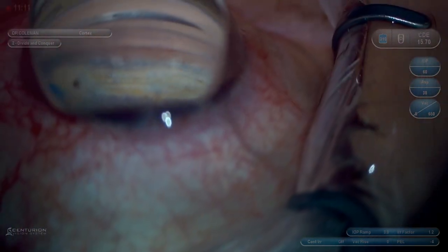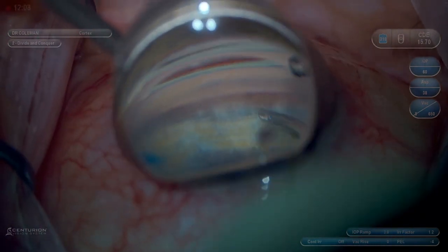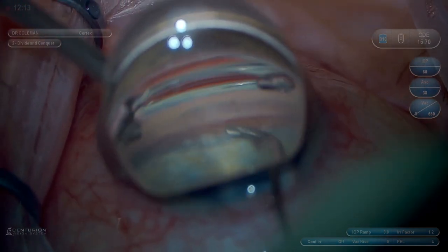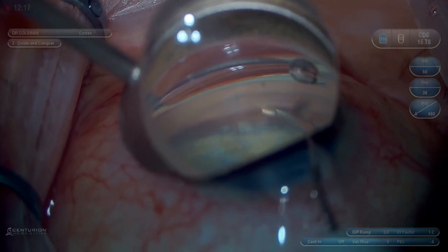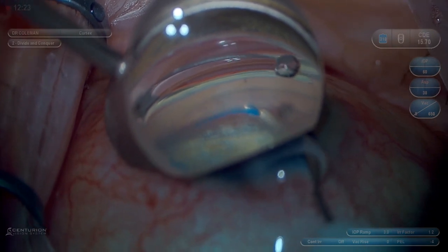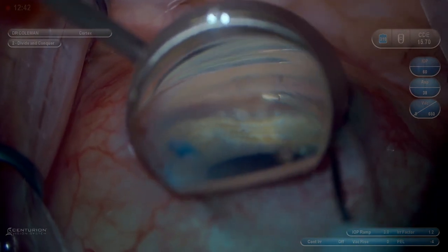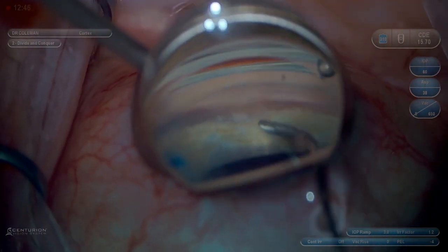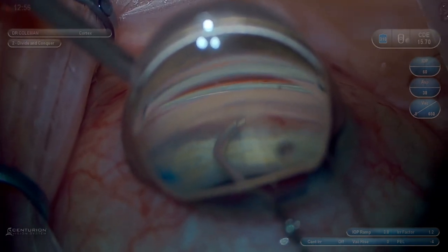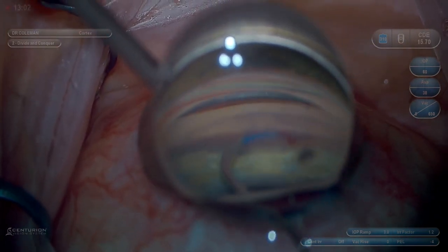This is the OMNI device for goniotomy and canaloplasty. It's important to point up slightly but not too much, because we want this to get into Schlemm's canal and not dive posteriorly into the suprachoroidal space. We like to visualize it passing through Schlemm's canal just below the TM. Now we'll rotate the OMNI to the other direction in preparation for 180-degree goniotomy. At this point there's no viscoelastic left in the cannula — we'll fully extend it and then pull it back through the trabecular meshwork to perform approximately 180-degree goniotomy.